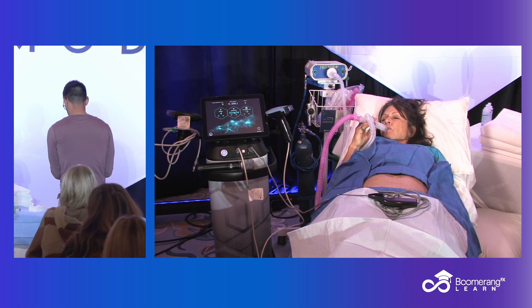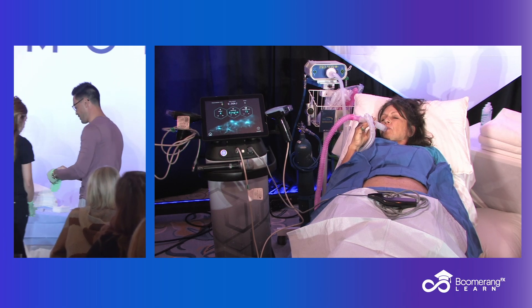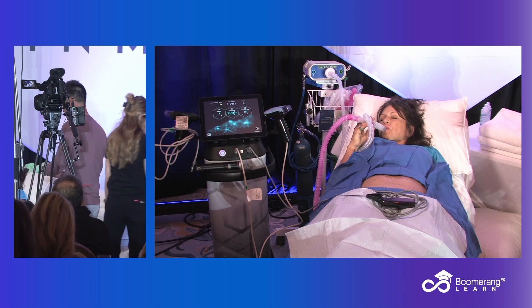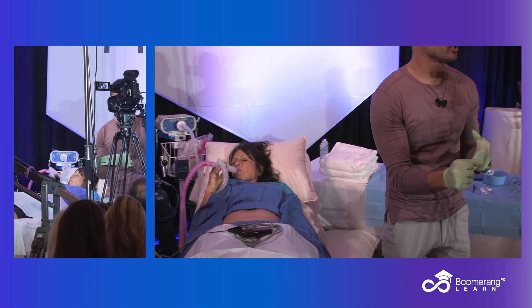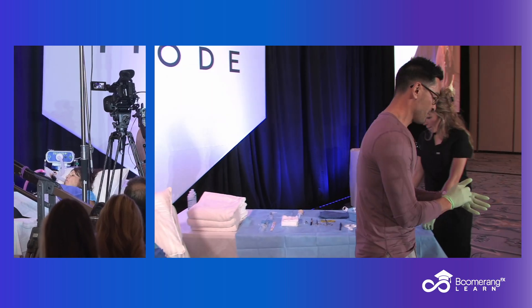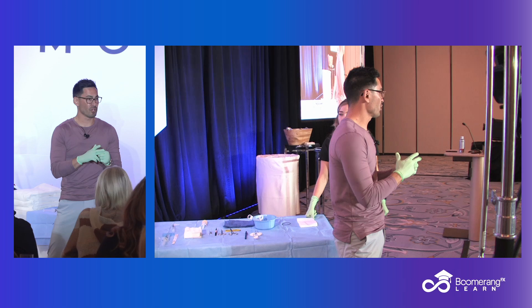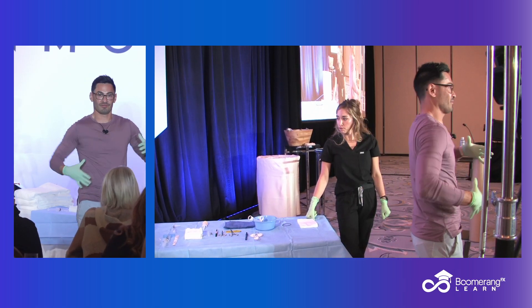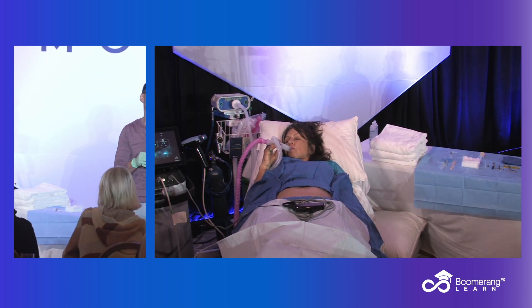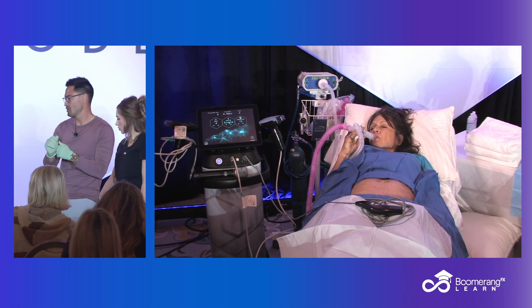This wonderful, amazing team has already pre-worked a little bit backstage just to make it more efficient. We have used our wetting solution, which you'll learn in your training. It's dilute lidocaine, which gives us the opportunity to use a little bit more volume should we need to, because it's inevitable that your patients are going to want a lot of areas treated. You can't inject straight lidocaine, so you'll run into lidocaine toxicity issues. So we dilute it down. You'll get all that during your training on what that mixture is.